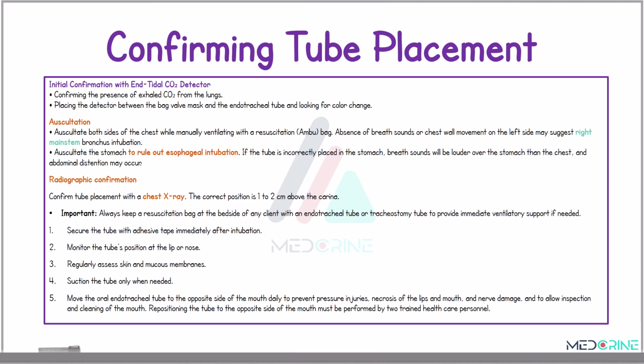It is important to always keep the resuscitation bag at the bedside of the client with an endotracheal tube or a tracheostomy tube available so that we can provide immediate ventilatory support in case it's needed.